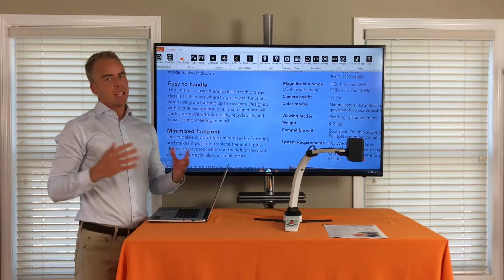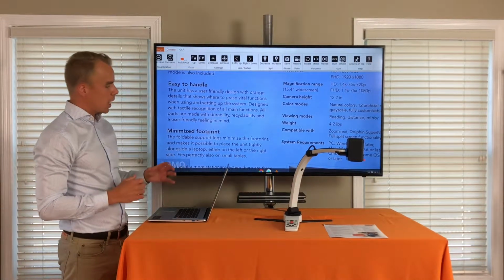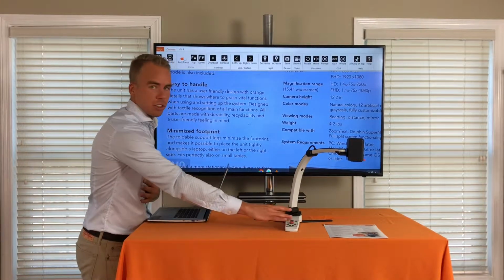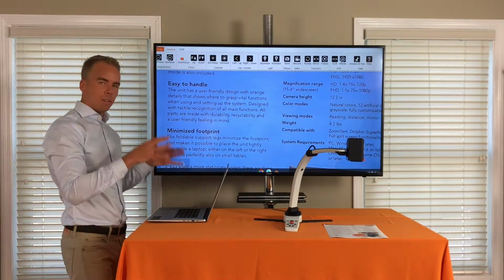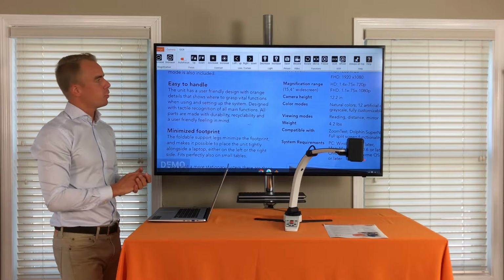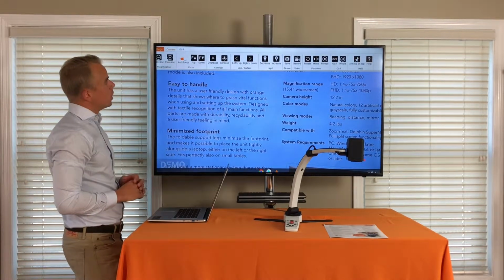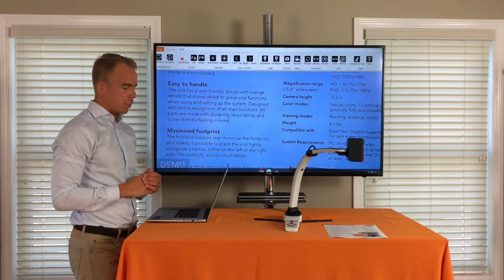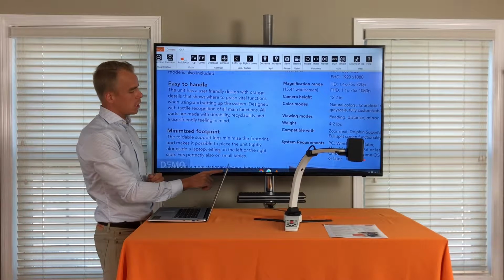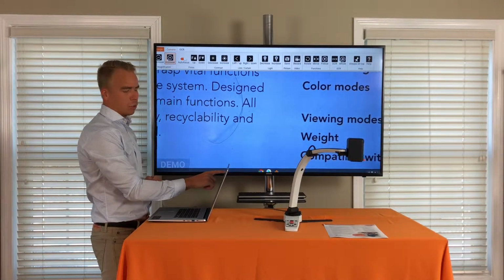I do have a couple of basic features and functions and some more advanced. So first of all, I can control my device with some functions here on the base. I have all functions available under short commands on my keyboard, and I also have an icon bar that you can see over here. If I have, like I have in this case, touch screen on my Chromebook, I can touch the screen on any of these icons and control it that way as well.